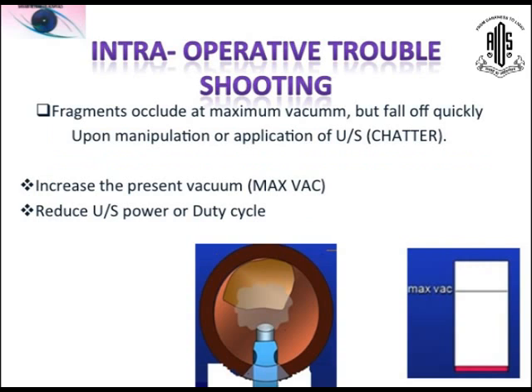Fragments occluded at maximum vacuum but fall off quickly upon manipulation or application of ultrasound. This is called chatter. Increase the preset vacuum, and reduce the ultrasound power or duty cycle.